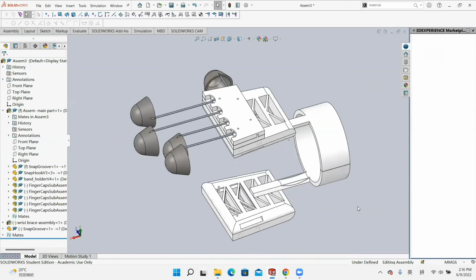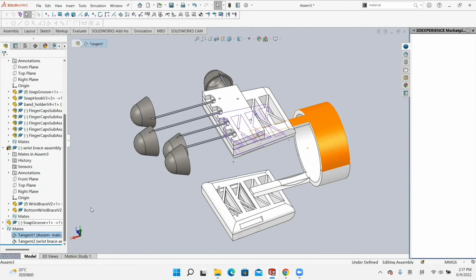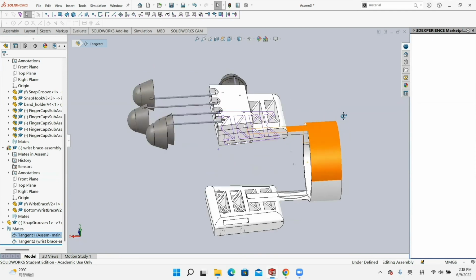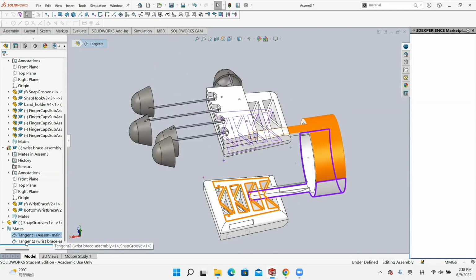Finally, we import the part we just talked about, and because in the prototype, the wrist brace performs its function of stability by just going through under the frame of the link part. So we do two tangent mates to make the wrist brace part contact with the bottom face of the frame part. In the first tangent mate, we choose the top face of the top wrist brace, selecting the bottom face of the frame part so it can be touched on each other.